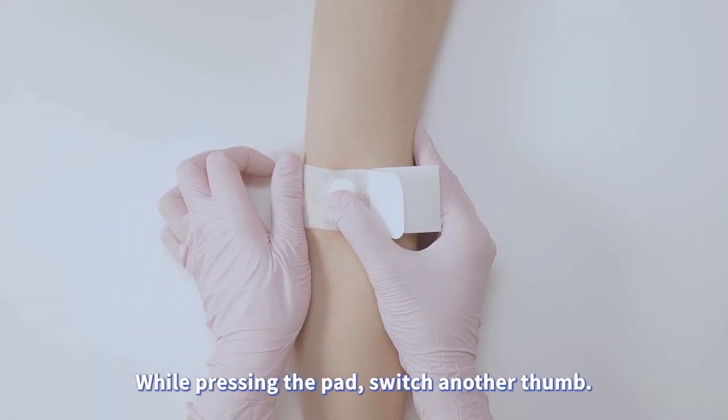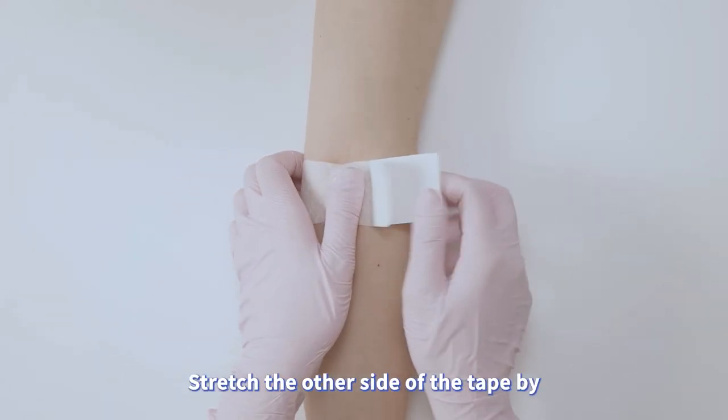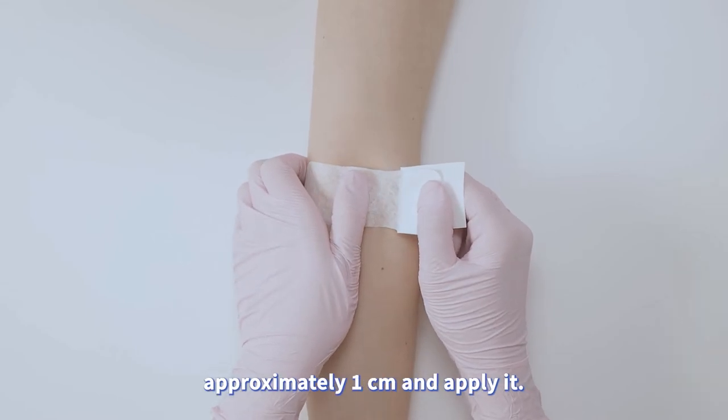While pressing the pad, switch to another thumb. Stretch the other side of the tape by approximately 1 cm and apply it.